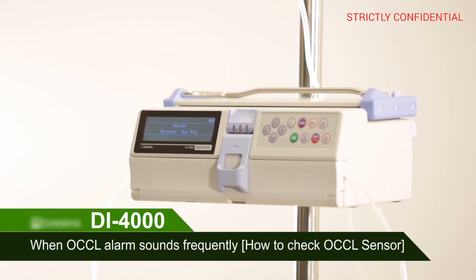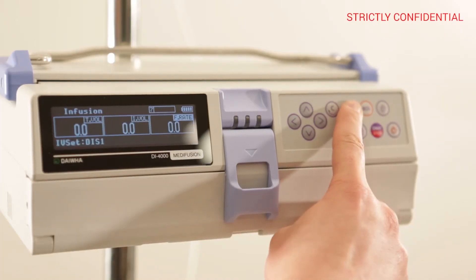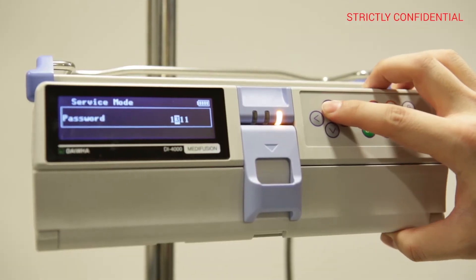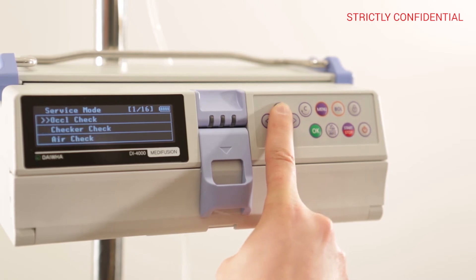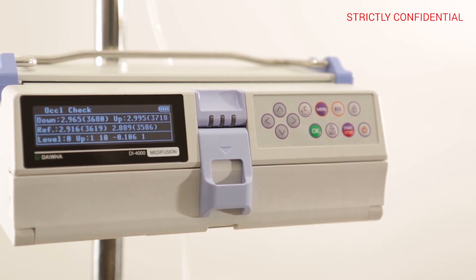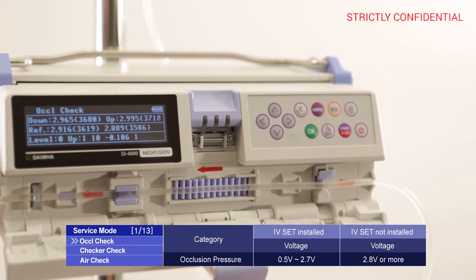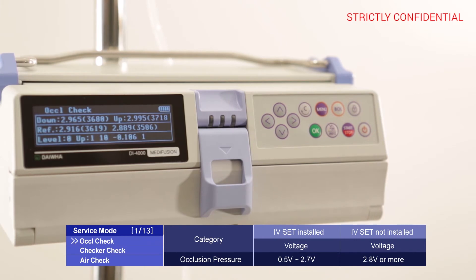When the OCCL alarm sounds frequently, press the menu button and enter service mode, inputting 1711 as the password. Use the arrow keys to enter the OCCL check. If the voltage value is between 0.5 and 2.7 when the IV set is installed, and 2.8 or greater when not installed, it is normal.